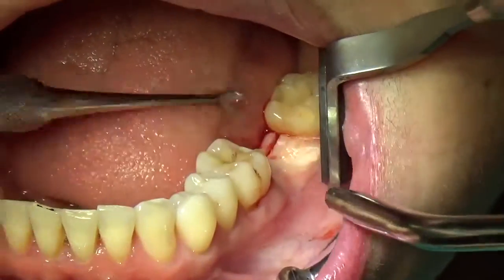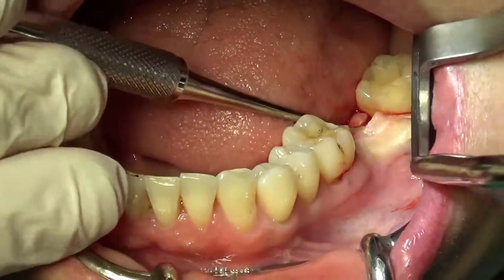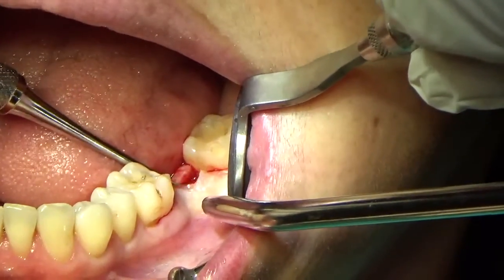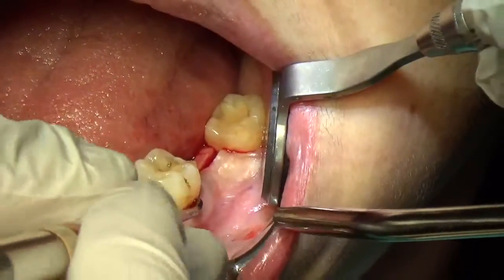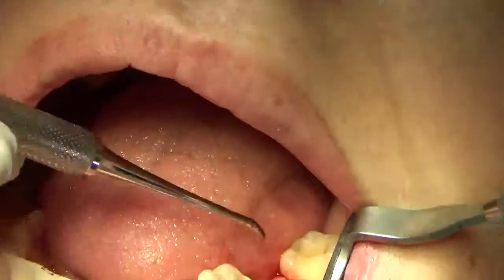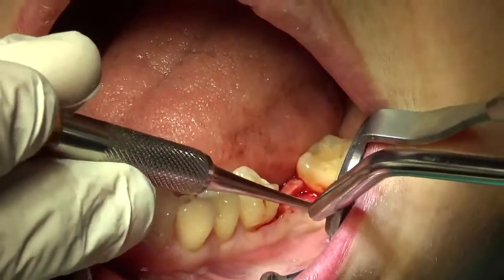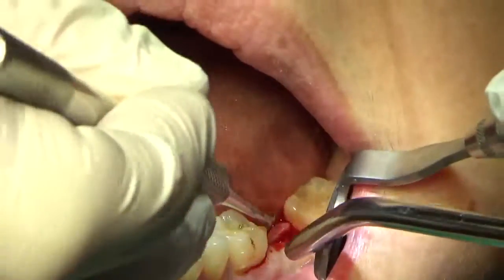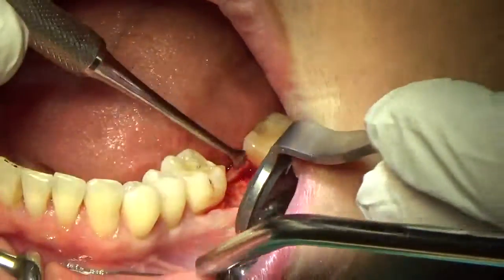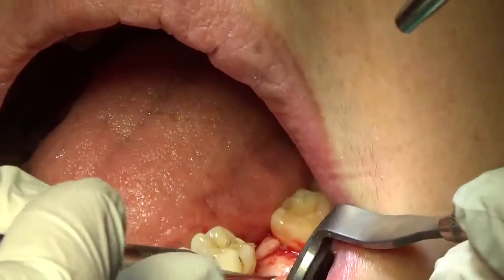So what I'm doing now is I'm taking this Molt elevator and I'm very carefully releasing that periosteum off the bone. Very carefully. So going all around. Slow, and like I said, that periosteum belongs to the flap. So very carefully going around. Little tiny bits, want to try to get it off. As we work our way apically, we can start to really visualize that defect as well.